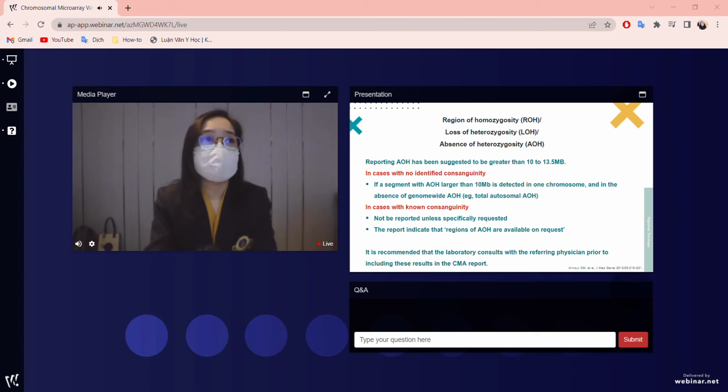And the last challenge is regions of homozygosity, loss of heterozygosity, and absence of heterozygosity. All of these are the same words.